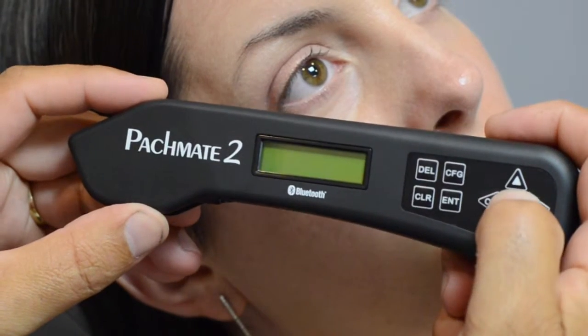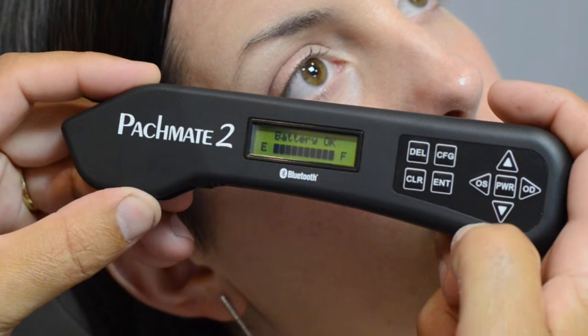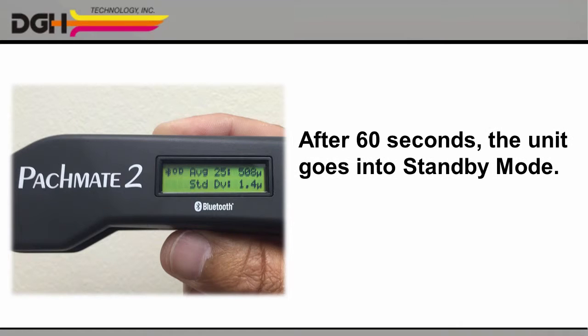Next, press the power button to turn on the unit. The PacMate II will automatically run a self-diagnostic. If all's well, it will show you the status of the rechargeable battery, and then it will prompt you to begin measuring the patient's right eye. Please note, if you do not begin taking measurements within 60 seconds, the unit will automatically go into standby mode to save the battery, and you'll see a black cursor blinking on the screen.